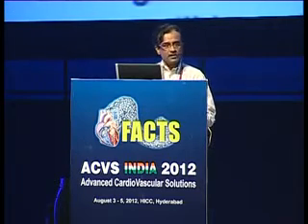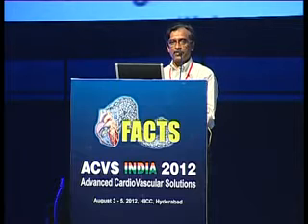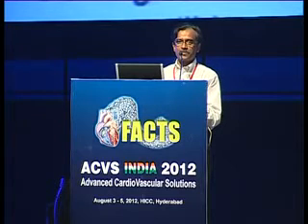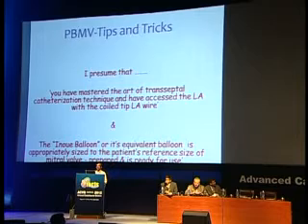Now, the purpose of this review is to reiterate some of the technical precautions and discuss some of the potential complications which can lead to the failure of the procedure, and I'll try to provide some tips while going through a few slides. So the vital component of balloon mitral commissurotomy is the transseptal puncture and transseptal catheterization.